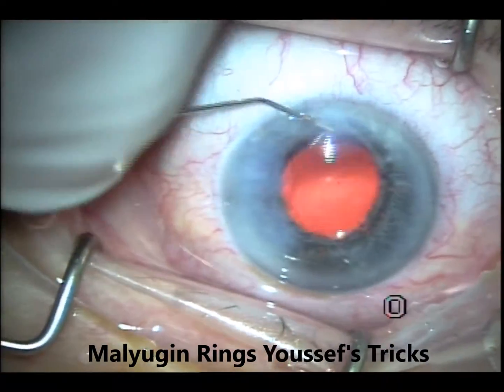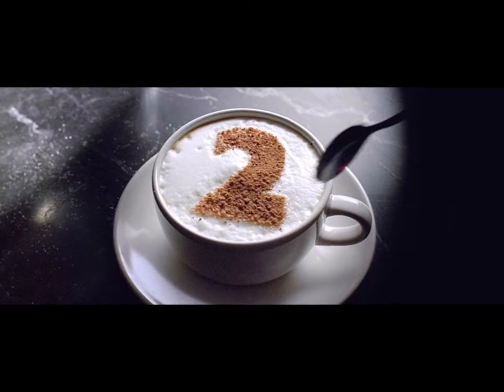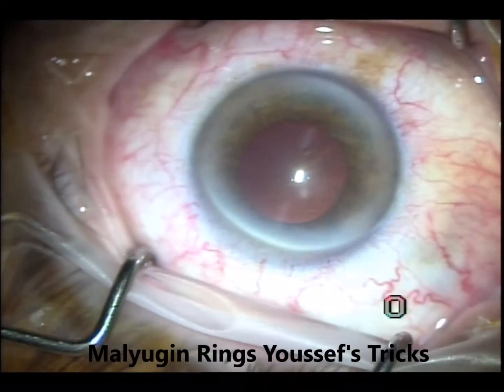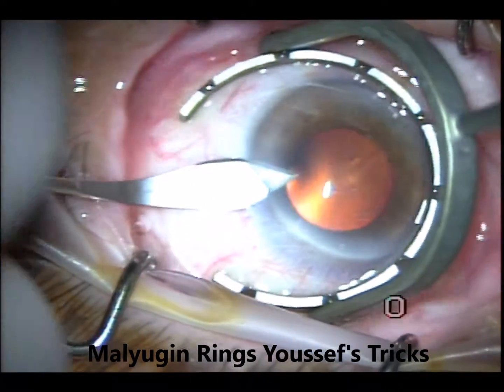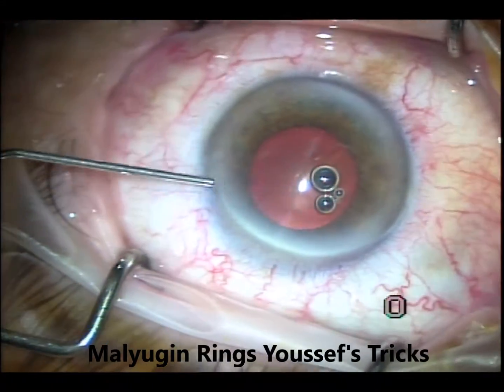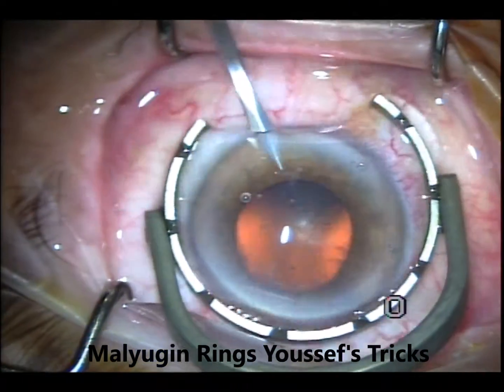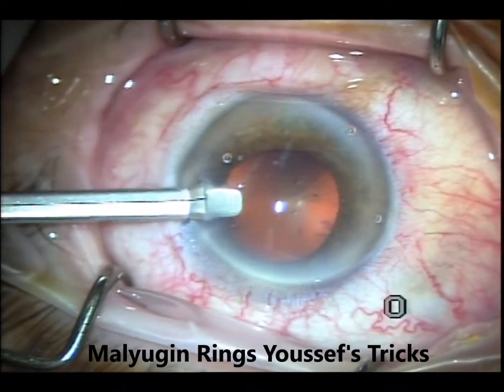This is the second case, which was a little bit different, because this cornea — if you notice here — is smaller than usual. This is a 13-millimeter gauge, so this cornea is about 10 millimeters or less. I noticed that at the time, but I fully realized it at the end of the surgery when I tried to remove the Malyugin ring.